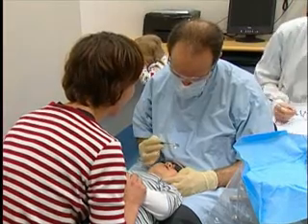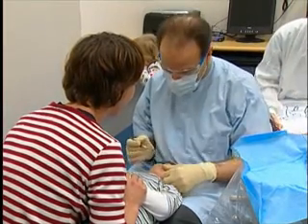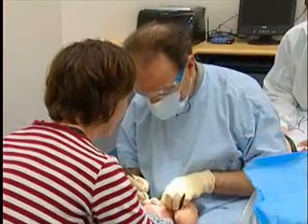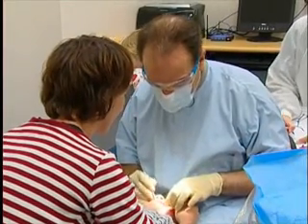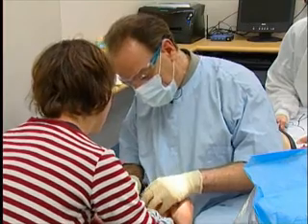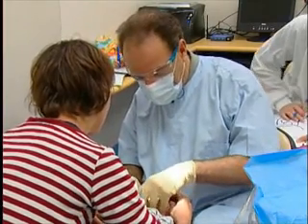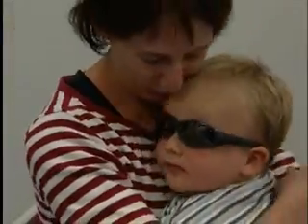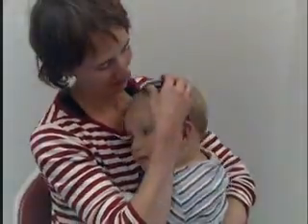child's needs. Can you see the mirror? Could you adjust the light for me, please, Jenny? Open for me, sweetie. Open again. Good. And down the lower ones. Let's have a look. And one more time, and we're done. In changing from chair-based to lap examination, a successful and positive outcome resulted.